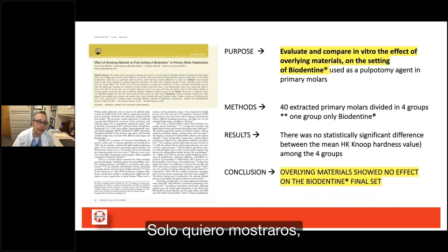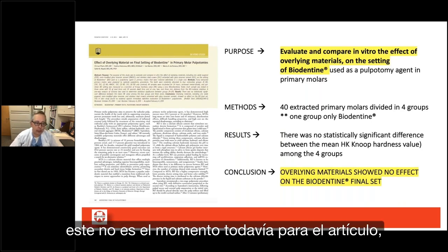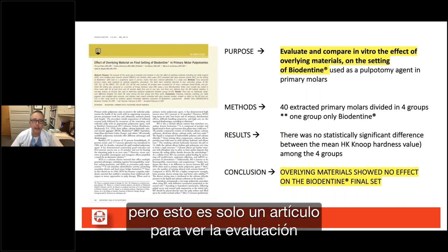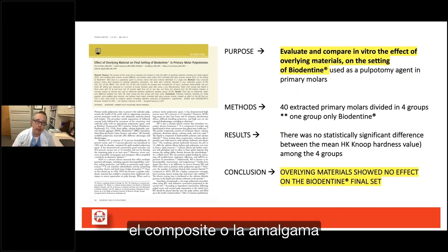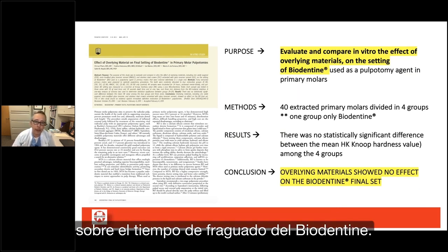I just want to show you, this is not the time yet for the article. The time for the articles is coming in a minute, but this is just an article to evaluate and compare in vitro the effect of the overlying materials, the composite or the amalgam, on the setting time of the Biodentine.